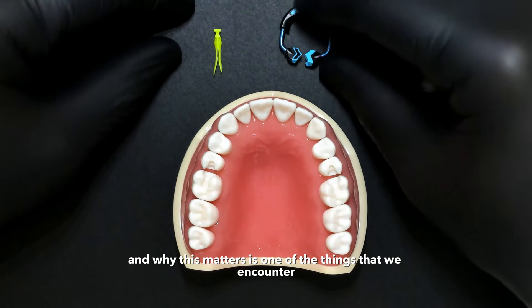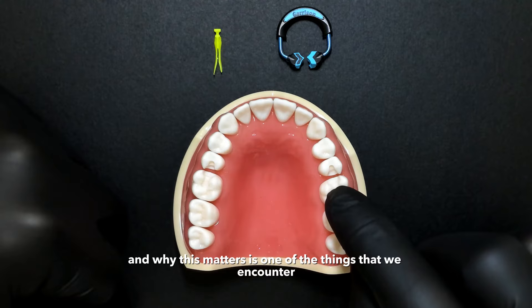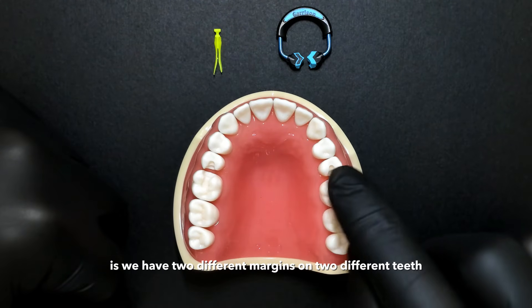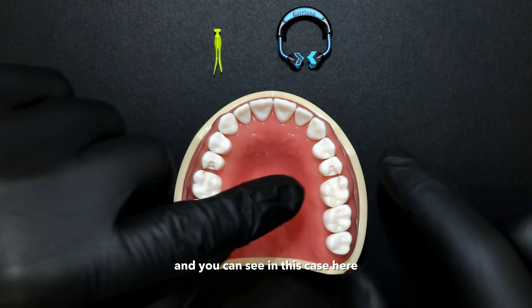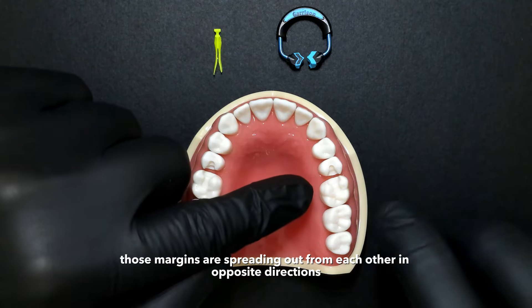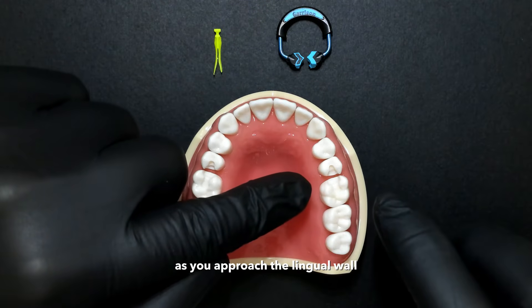Why this matters is one of the major problems in back-to-back situations: we have two different margins on two different teeth. And you can see in this case, those margins are spreading out from each other in opposite directions as you approach the lingual wall.